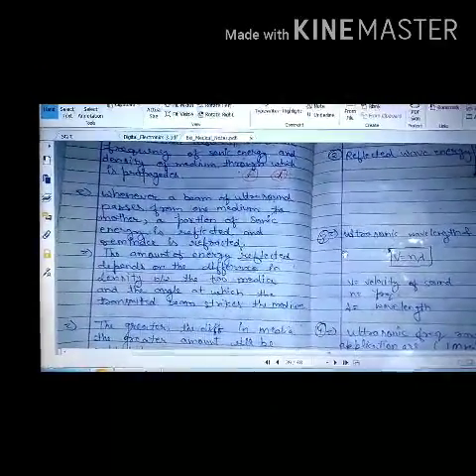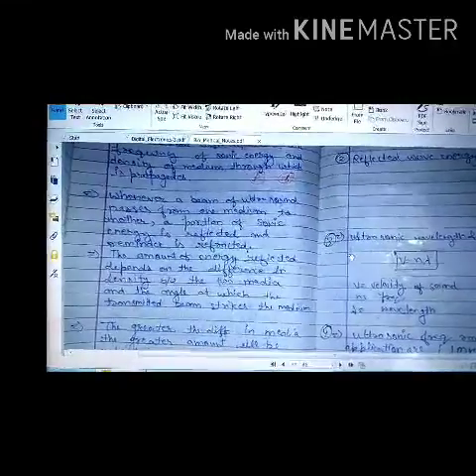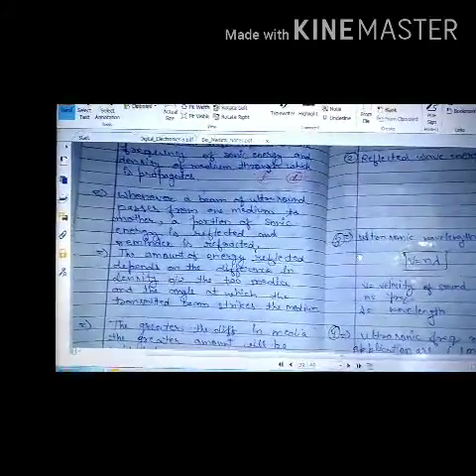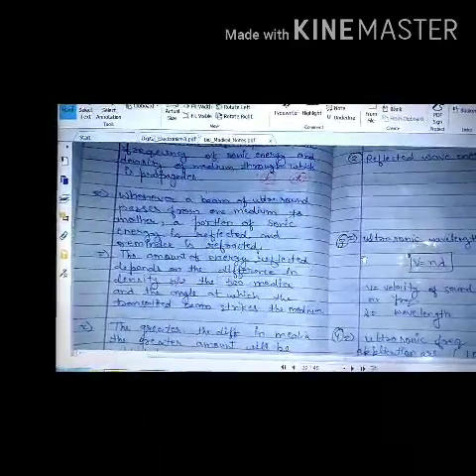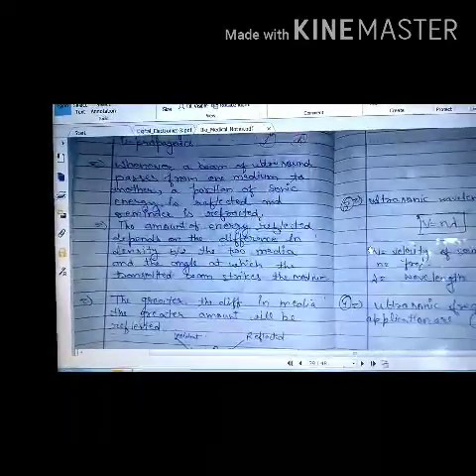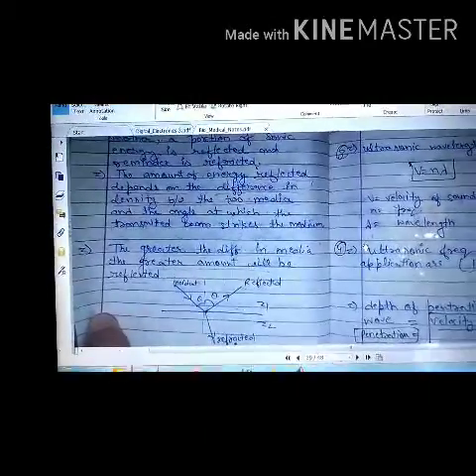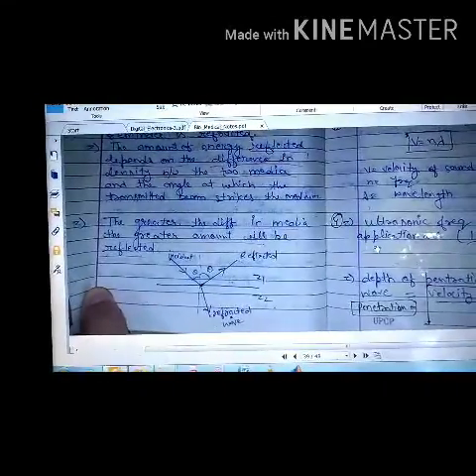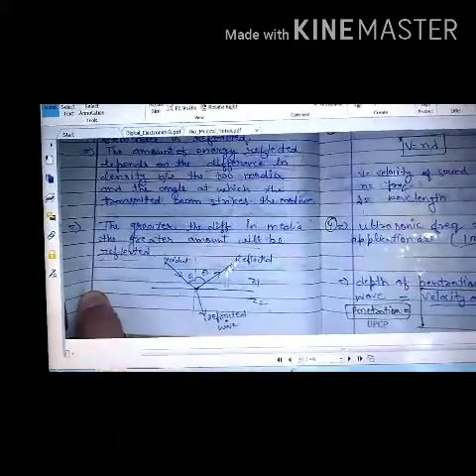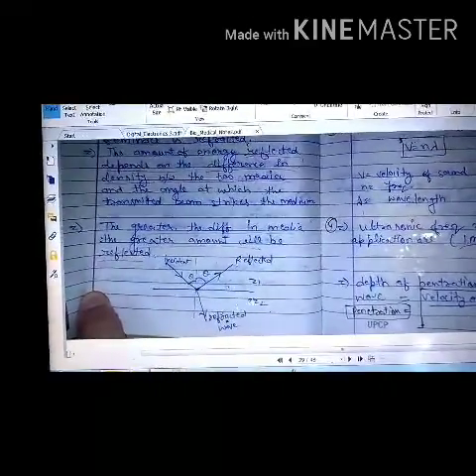So it is very similar to the methodology of light reflection. It depends upon the angle at which the waves are hitting and the density of the medium from which they are being reflected back. The greater the difference in the medium, the greater the amount that will be reflected back. So depending upon the density, more waves will be reflected back and fewer will be refracted inside the medium.